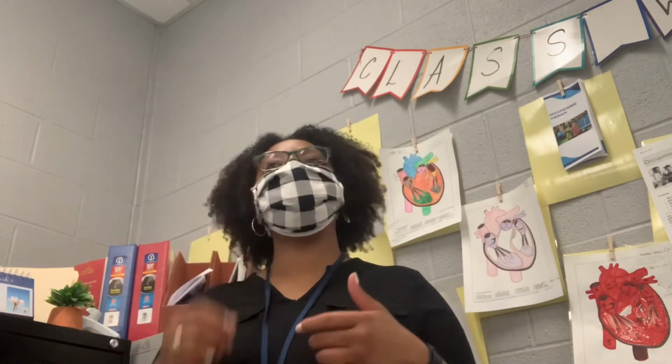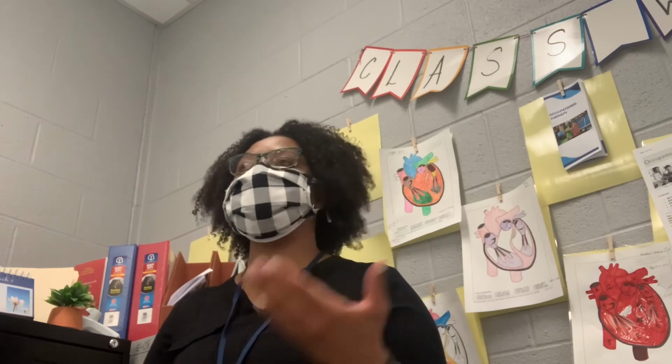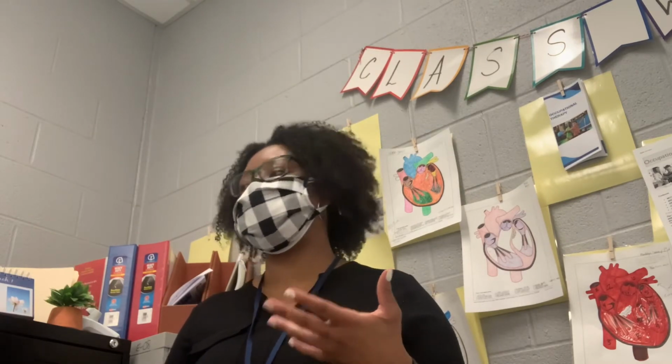You know, when you get used to doing it, then you can do it like you're listening to their breath sounds with the stethoscope. You can hold the stethoscope on them a little bit longer and listen to their breathing. If you're checking their pulse manually, you can get the pulse and then you can count the respirations. So you have to do it where the patient doesn't know that you're doing it. So even though this is our activity today, try not to breathe abnormally while they're trying to count it, okay?